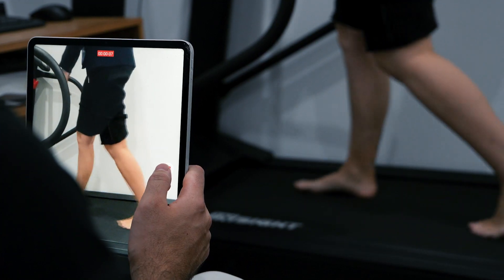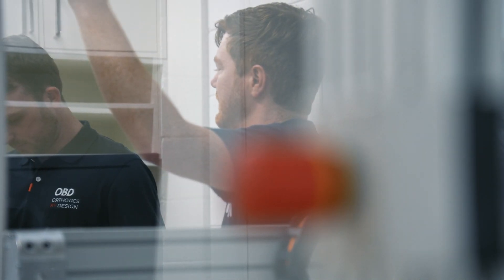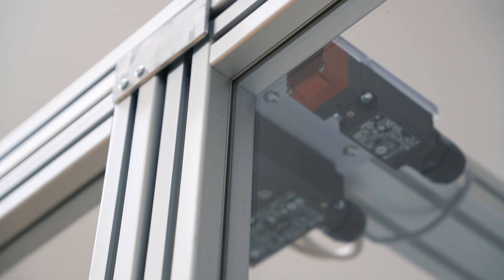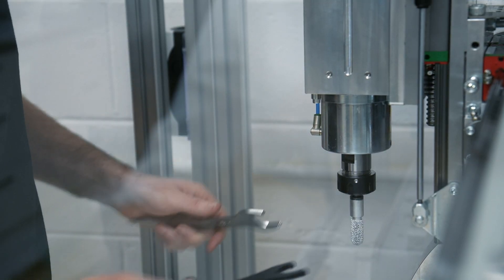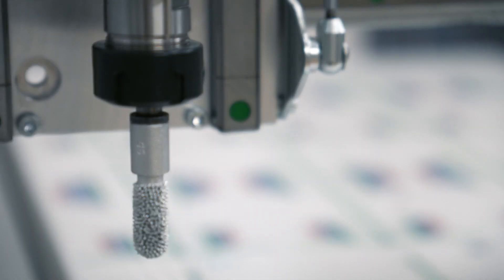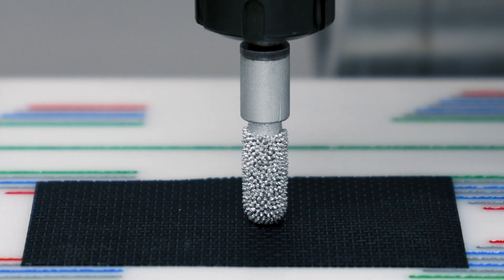When we heard that Laser Cam Orthotics and 5.0 Robotics had come together, we were really excited — we're taking the best design software and combining it with one of the best CNC robotic companies. That combination is going to get really good outcomes, and that's why, as a podiatrist now moving into manufacturing, we thought this system had to be the next state-of-the-art solution. We've onboarded it today and it's a really exciting time for both companies.